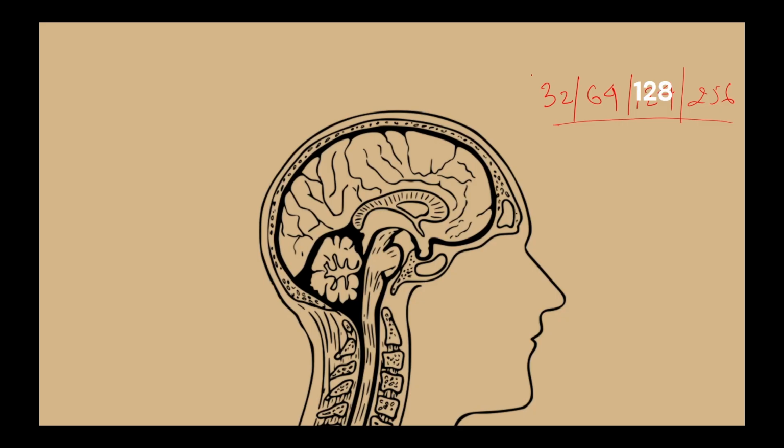These are the common ones. There are even recordings with 1024 channels, so it can be very dense. But commonly we use this many channels.